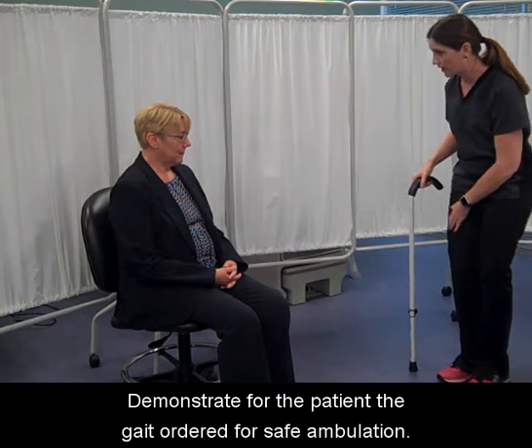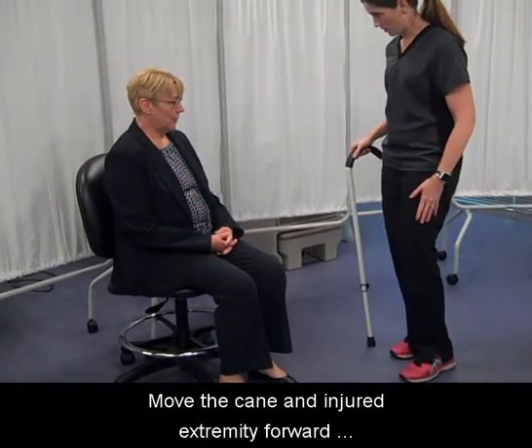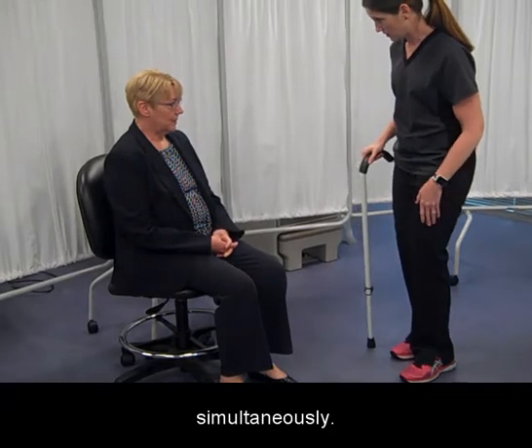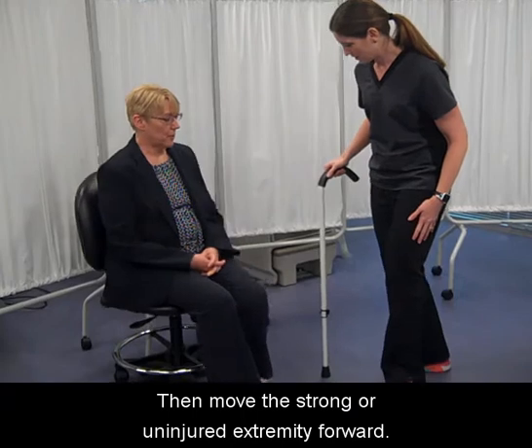Demonstrate for the patient the gait ordered for safe ambulation. Move the cane and injured extremity forward simultaneously, then move the strong or uninjured extremity forward.